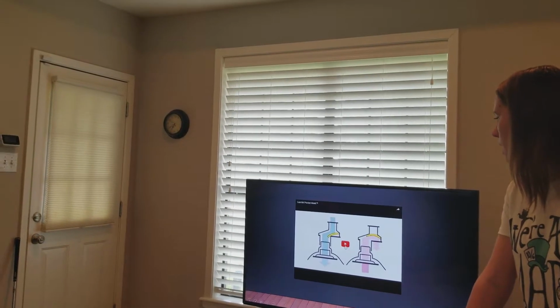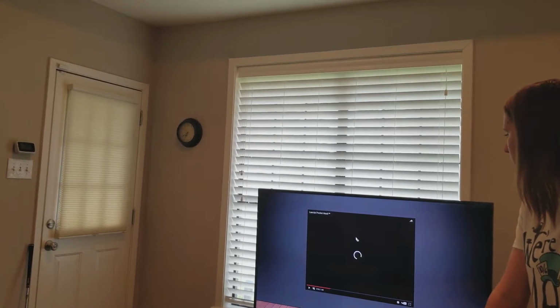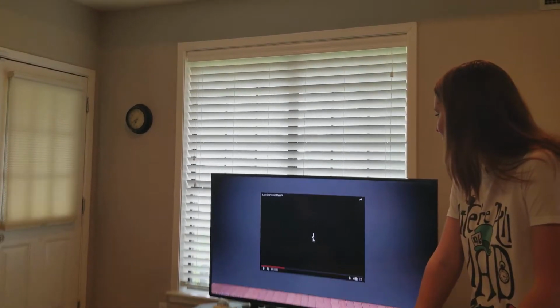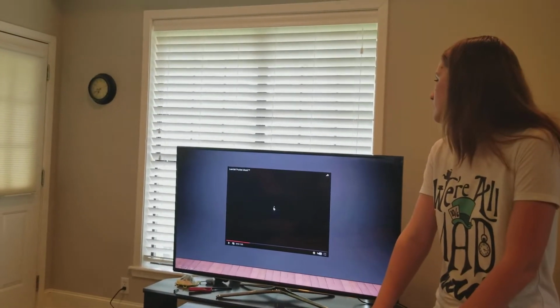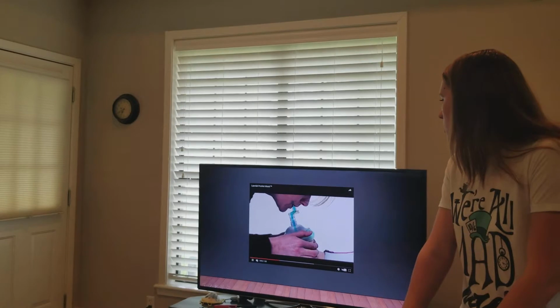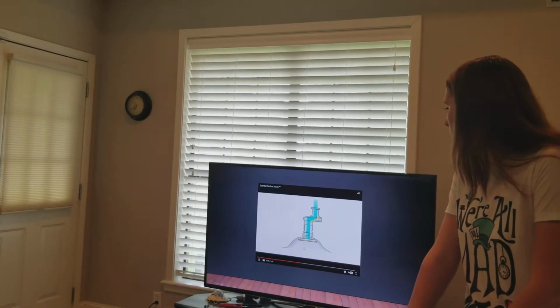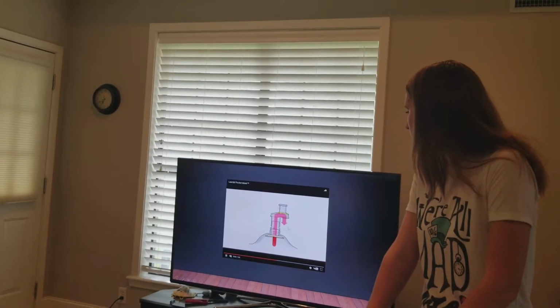This video actually shows how the valve prevents spit and the person's air coming back and forth between each other, if it'll load. So these little dots are your spit, and it's caught by the cotton part of the valve, and when the air from the person that you're giving CPR to is released, this little valve pops up and is released out the other side.